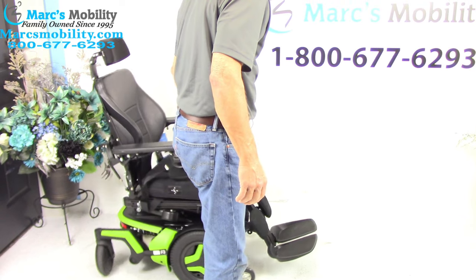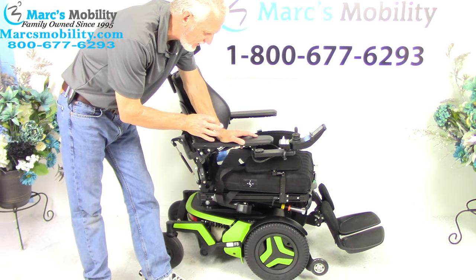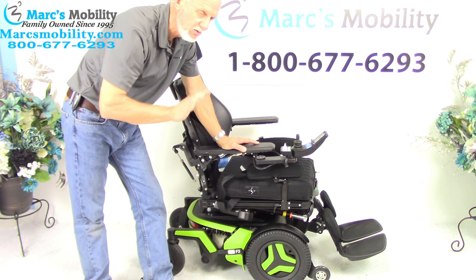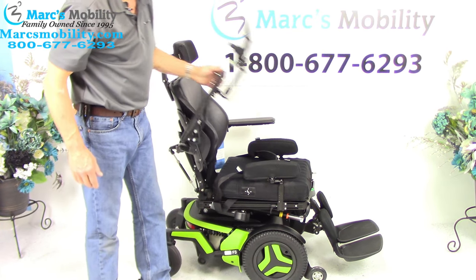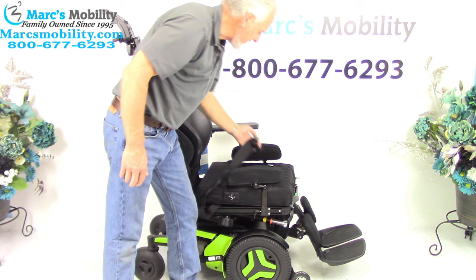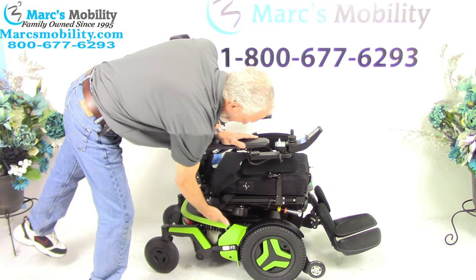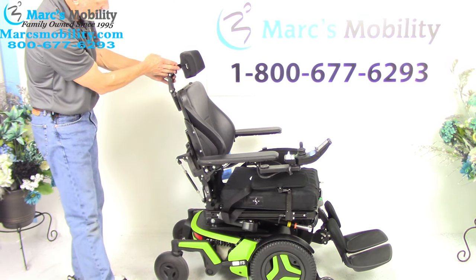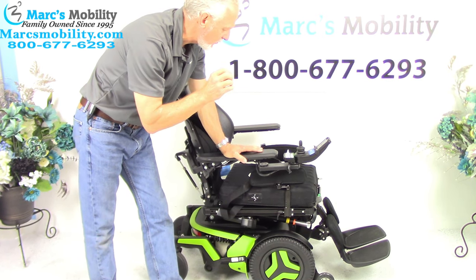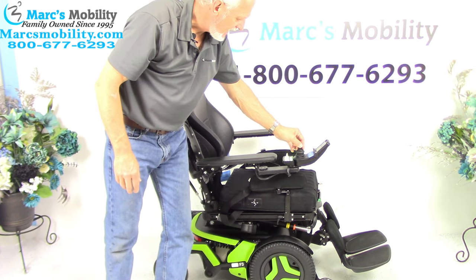So let's recap. This is a Permobil F3 power chair — the newest technology available right now, the latest model. This is the F3 power chair with the electric tilt, the electric recline, the electric legs. It also has a flip-up arm, the swing-away joystick, the lateral pads for your knees, a safety belt, the air cushion, the anchor point, the famous Permobil suspension, the adjustable headrest, and the adjustable tilt on the arm. Just a beautiful power chair with two miles — if you're looking for something really sharp, neon green, this one is as new as you're going to get with three electrical functions, and it's ready to go.